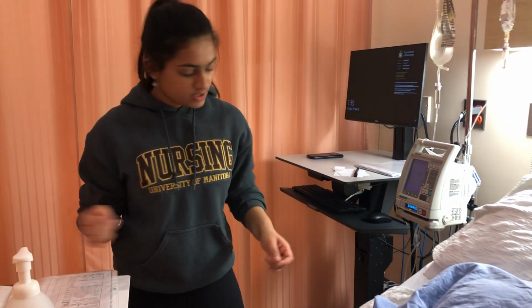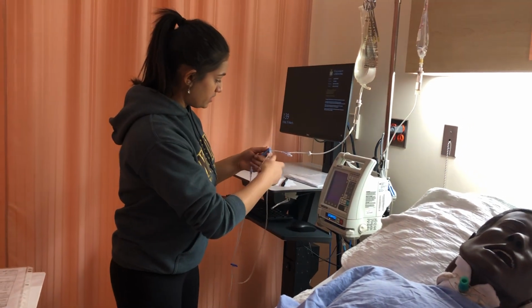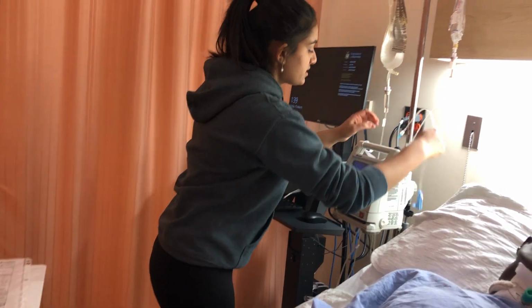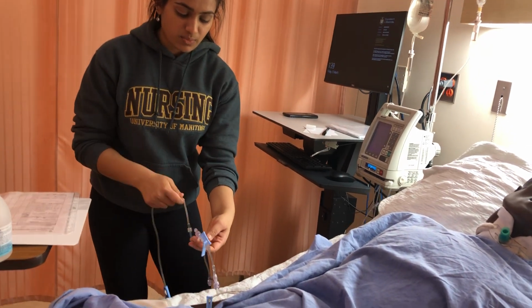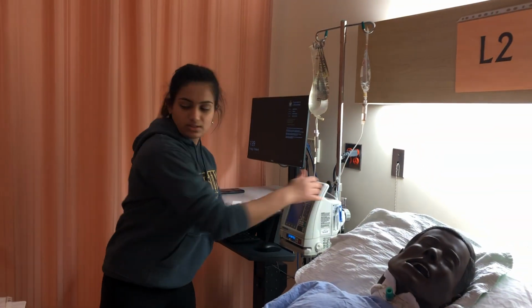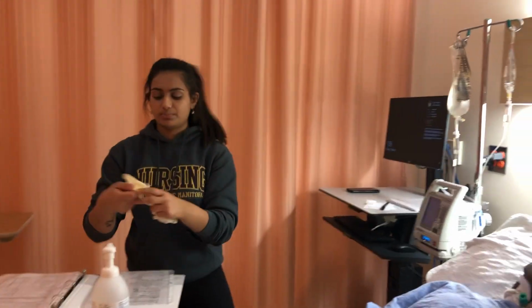So now that we've done that, I'm going to attach it to my patient. So this here is the primary. And this is my continuous. So this is going to be going into the Y side, which will be connecting to my patient and going through together. So I'm going to just perform hand hygiene once again, and then put on gloves.